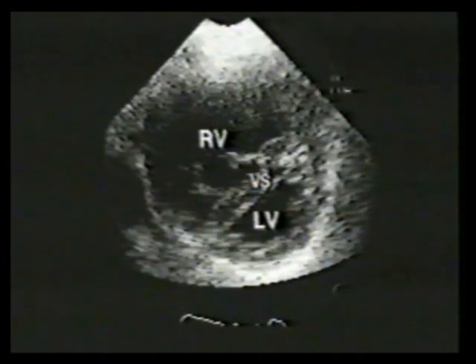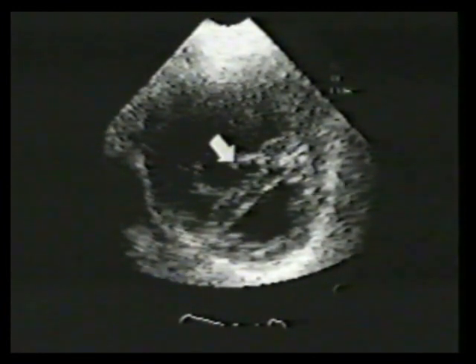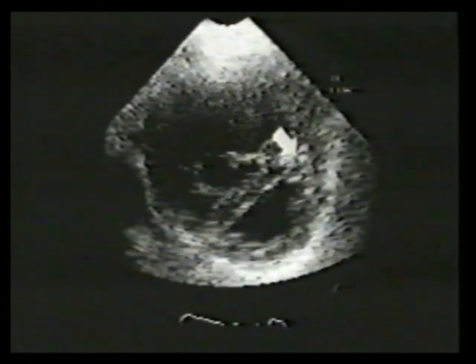This young female with severe primary pulmonary hypertension has developed severe enlargement of the right ventricle with hypertrophy of the trabeculae. Pressure overload on the right side has flattened the ventricular septum, giving the left ventricle a D shape.